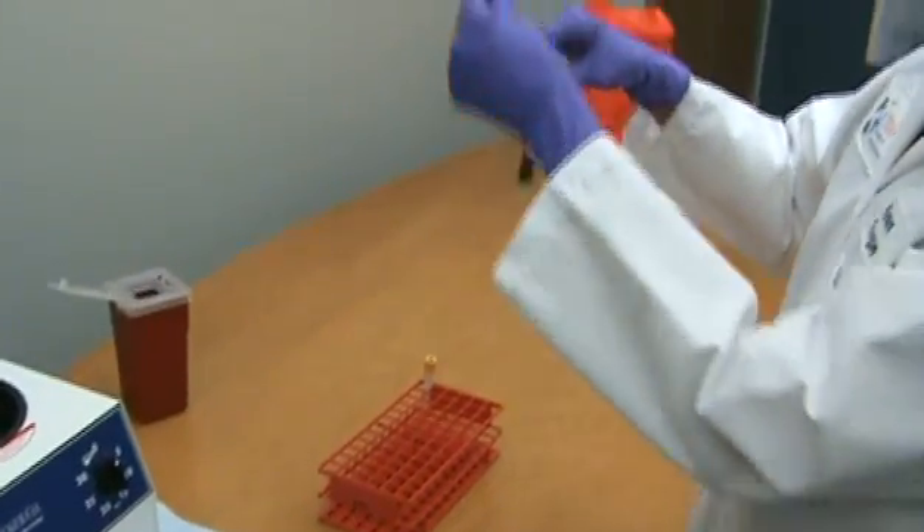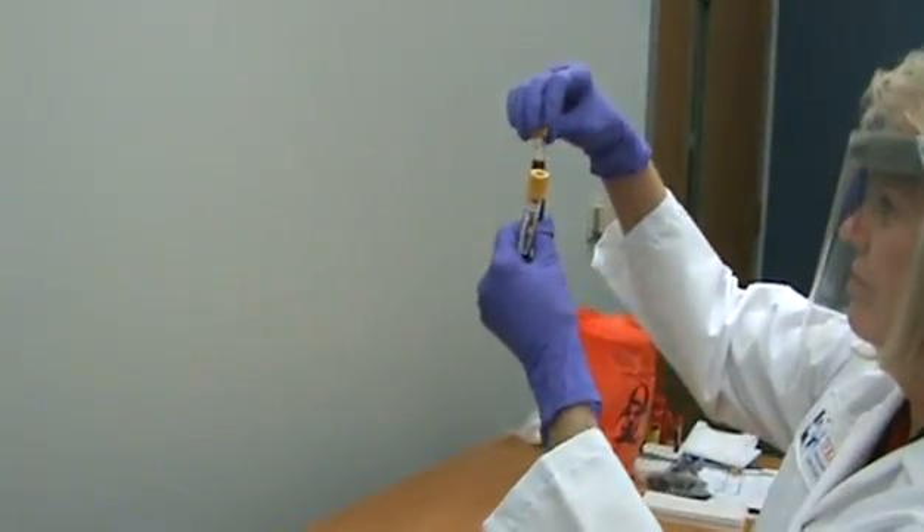The tube should be re-examined for any hairline cracks that will cause the tube to break during the centrifugation process.